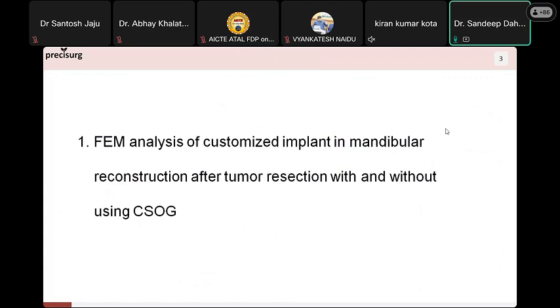Why did we obtain lower stress and strain as compared to case 4, where the maximum gap is available on both sides? Because you can see in the figure the red zone, that is case 1. You can see in case 1 the red zone on both sides of the implant. When we use a custom surgical guide, then cutting is performed properly. Because of the proper cutting, the implant is exactly fitted at the planned location and the surfaces of the implant properly touch the bone surfaces.